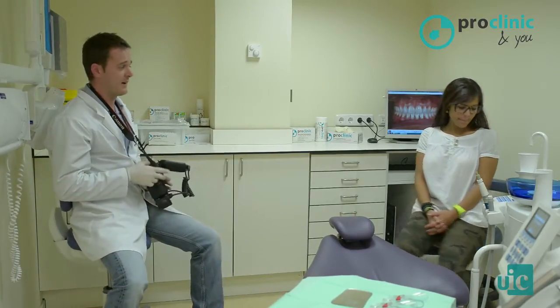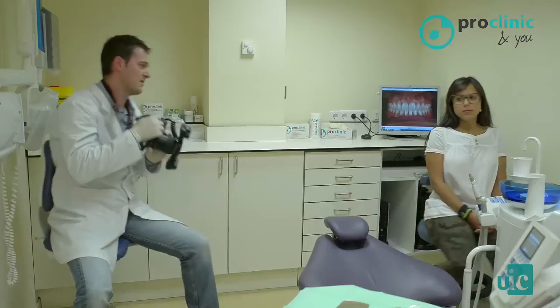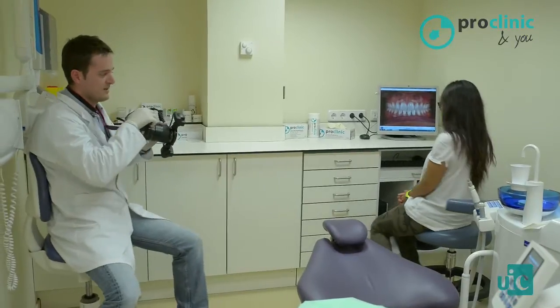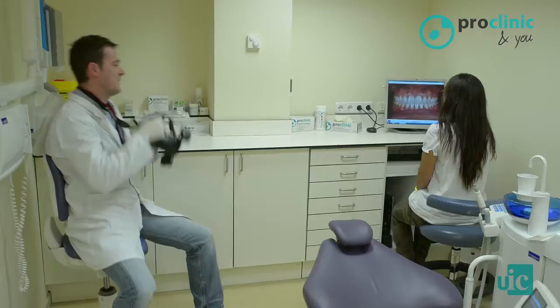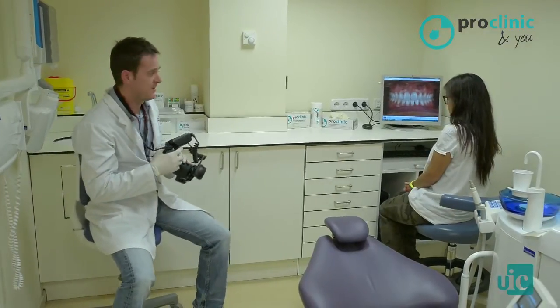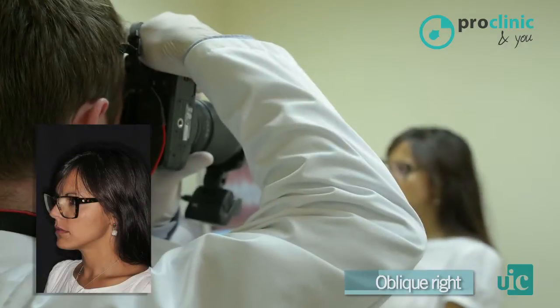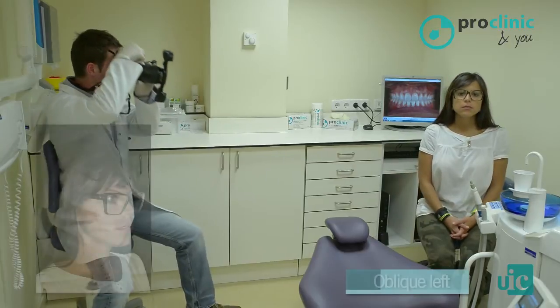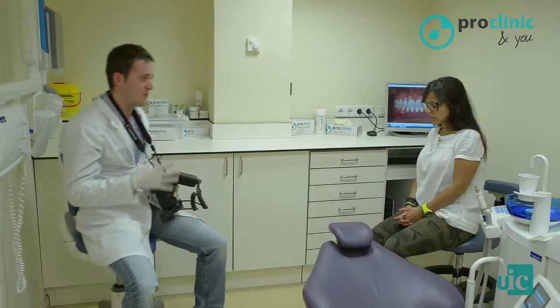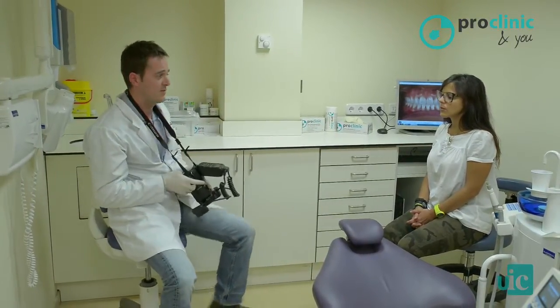We should ask the patient to turn 90 degrees, first to the left to take the right side picture, and then rotate to the right. Oblique photos, right and left. We take two oblique photographs, asking the patient only to turn 45 degrees. After obtaining the full-face photographs, we must repeat the sequence, photographing only the lower third of the patient's face.